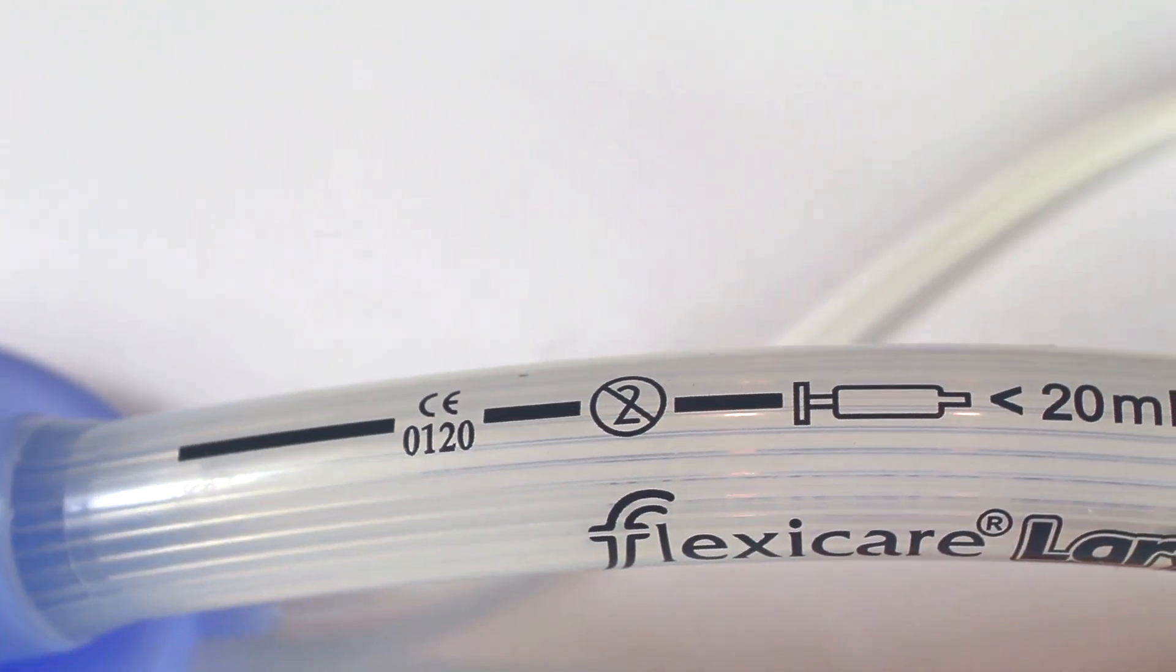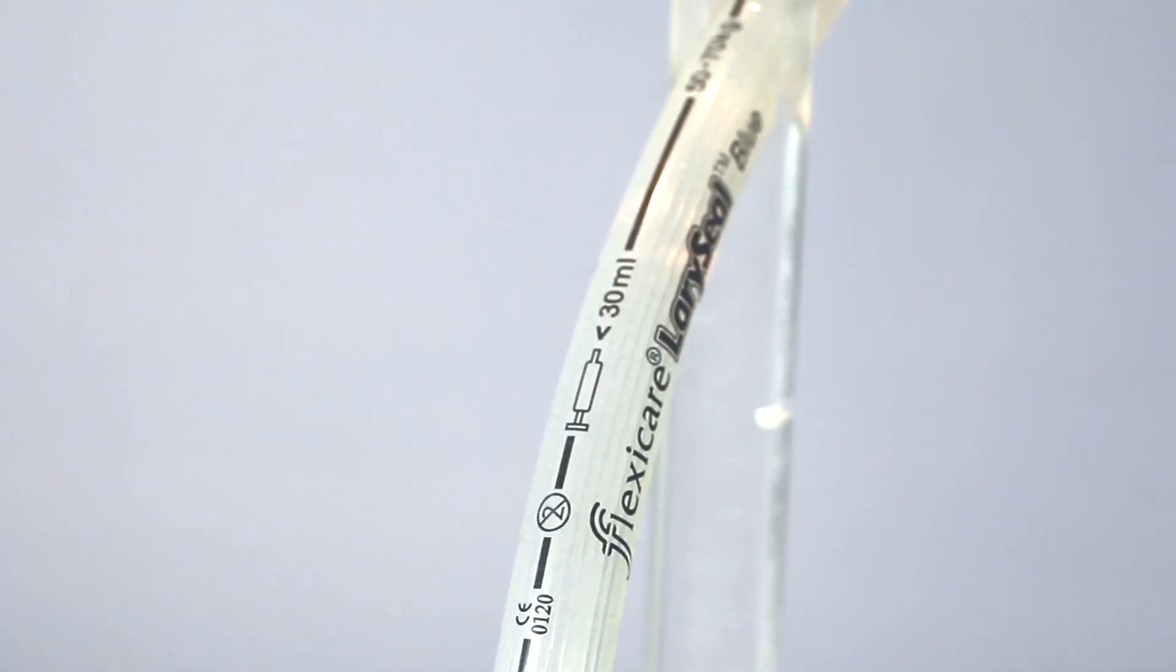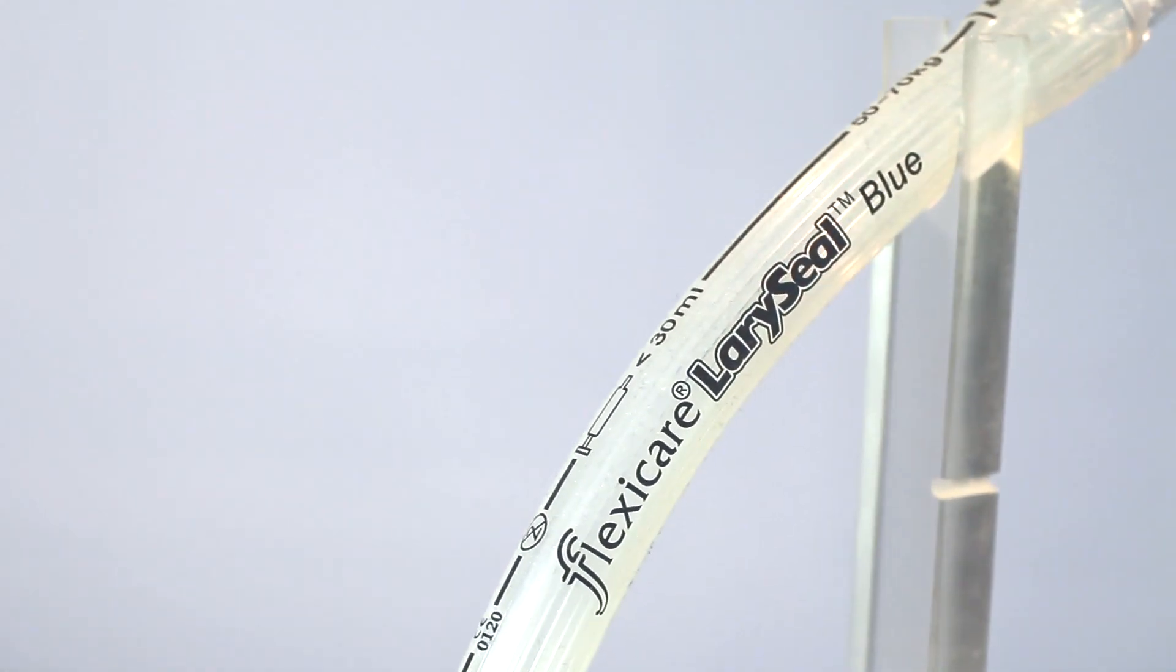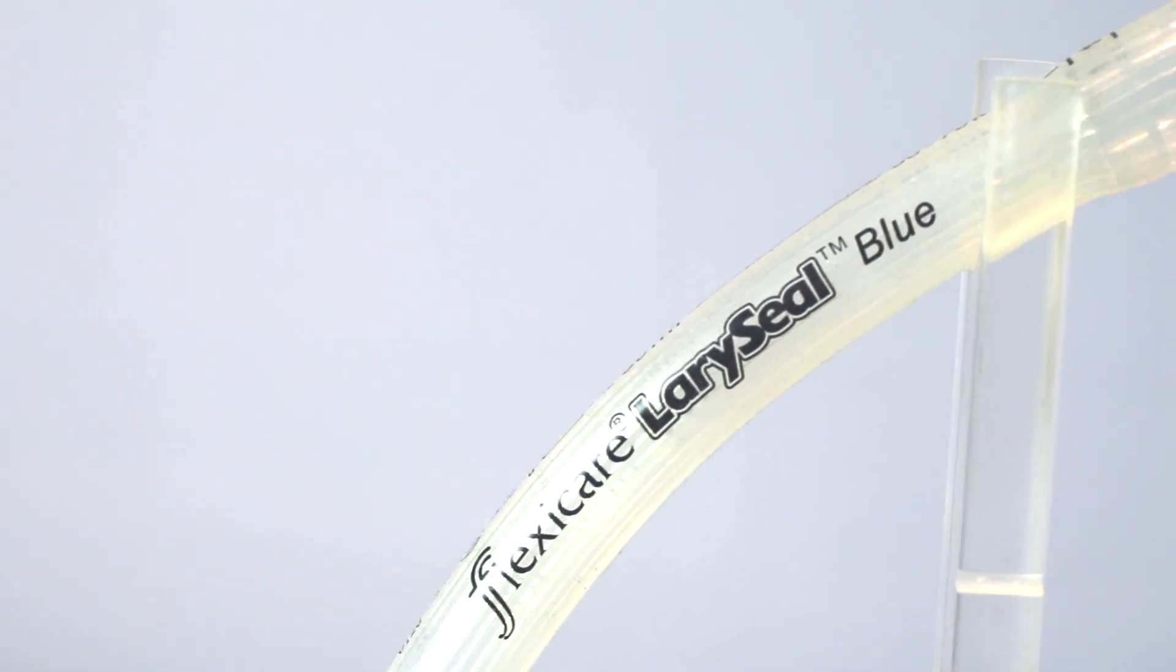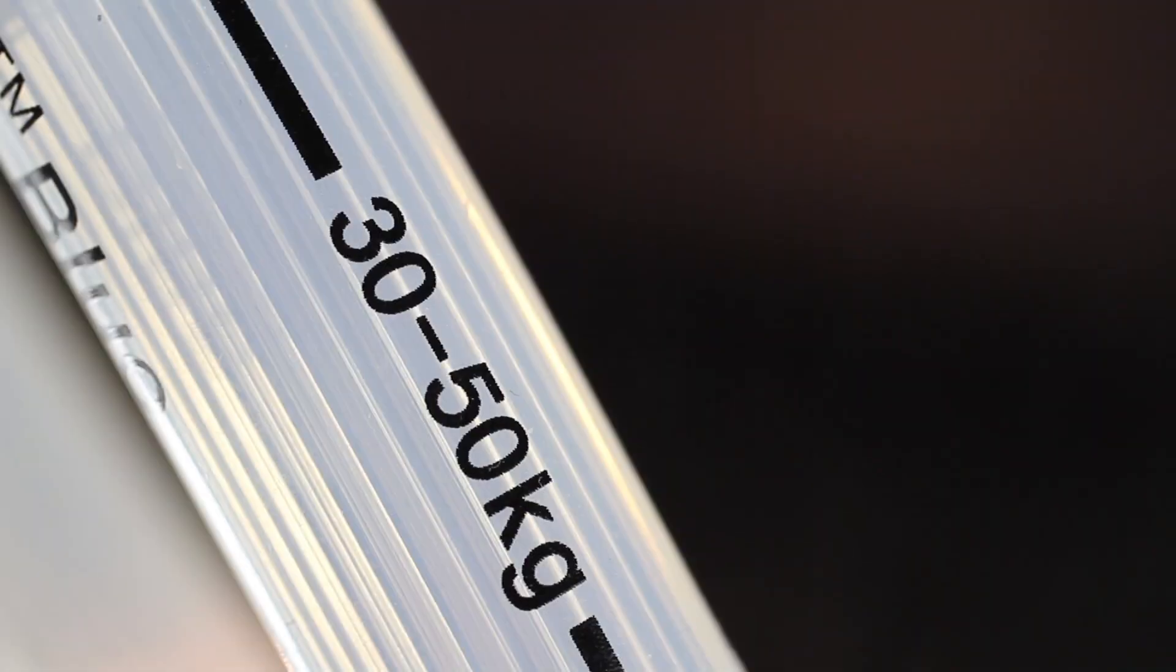Inspection of the Laracel Blue reveals all the essential information visible on the main tube. This allows the user to reaffirm the correct choice and insert Laracel quickly and effectively. You will see that the Laracel main tube clearly indicates approximate patient weight near the 15 millimeter male patient end connector. In this instance the indicated weight range is 30 to 50 kilograms Laracel size 3.